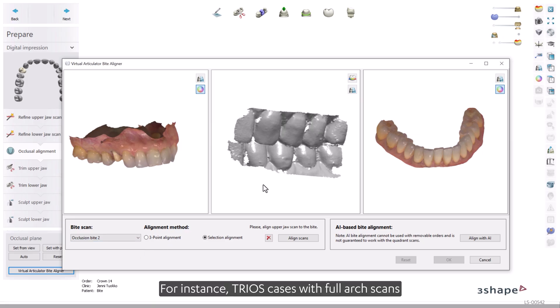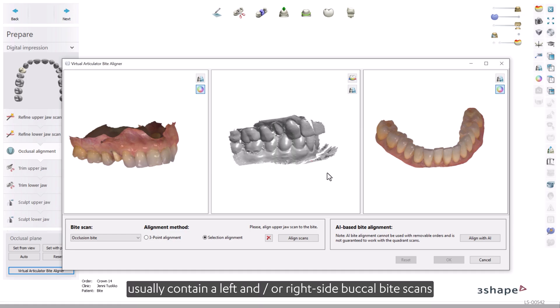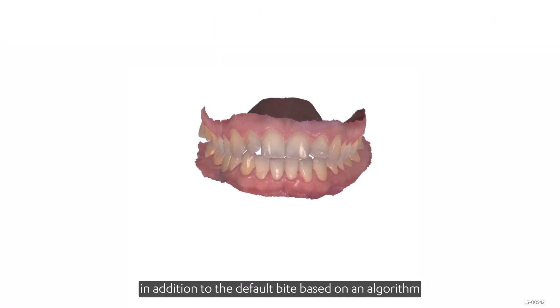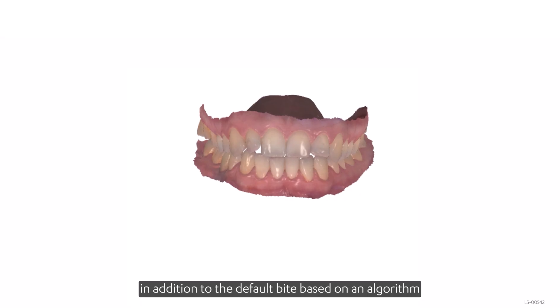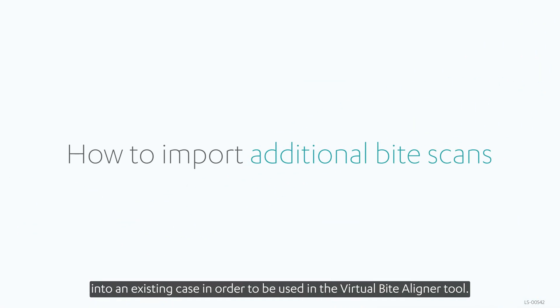For instance, TRIOS cases with Full Arch scans usually contain a left and/or right-side buccal bite scans, in addition to the default bite based on an algorithm. Next, we will go through how additional bite scans can be imported into an existing case in order to be used in the Virtual Bite Aligner tool.